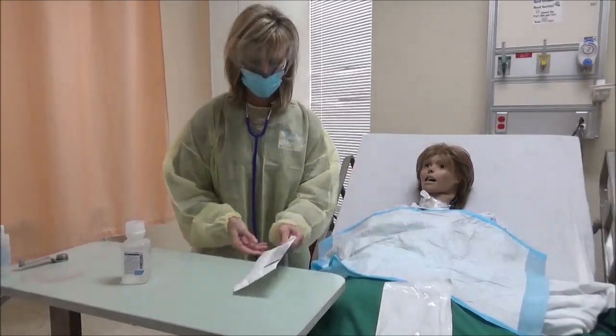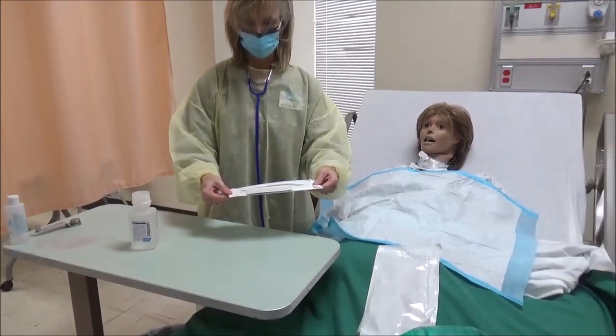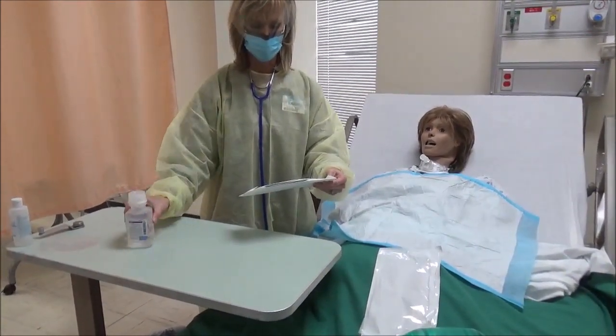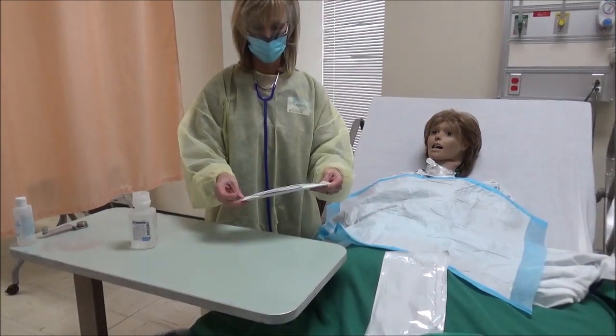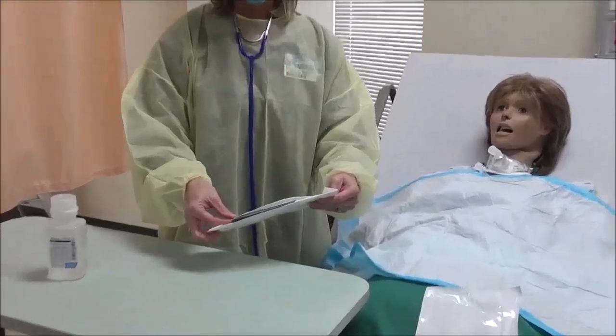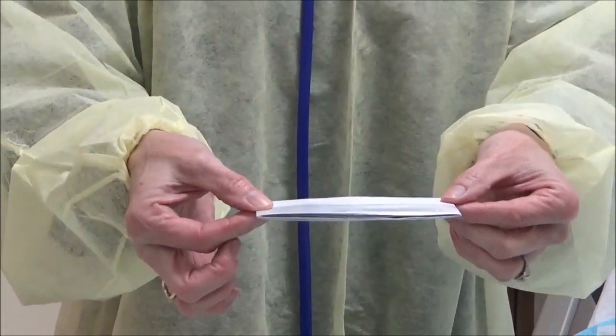Okay, now when I open up this suction equipment, I notice that there is the box that is going to contain my sterile water. That needs to be kept sterile, but there are parts of it that I can touch. So I'm going to grab the box here, and it has a clear plastic lining on one side.